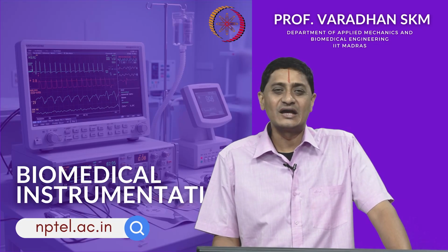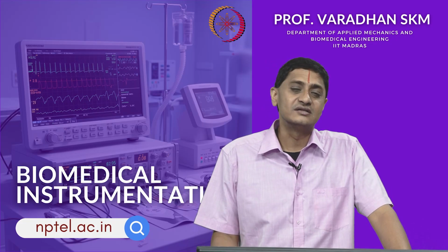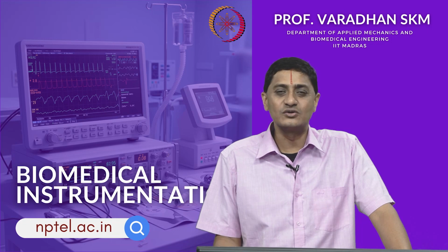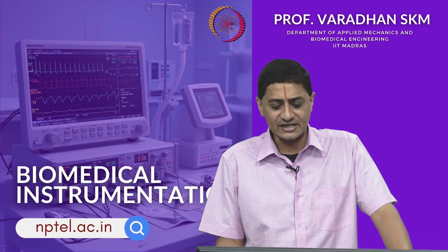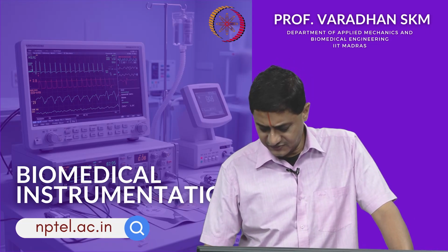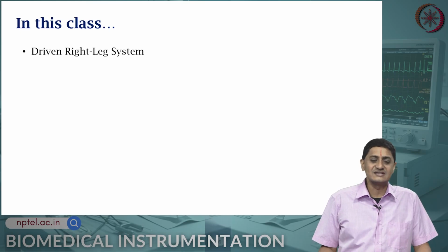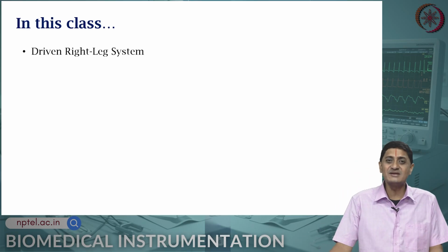We have been looking at ECG and we looked at valvular pathology. Before that we looked at the Cabrera system and limb leads, and we had an overview of ECG and the electrical activity. In this video we will look at the driven right leg system for ECG, which is essentially a feedback system to minimize noise and improve noise performance.